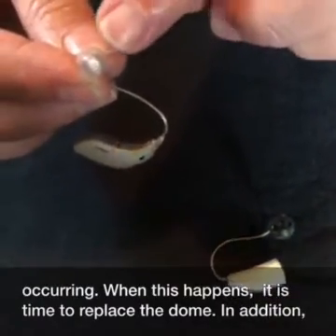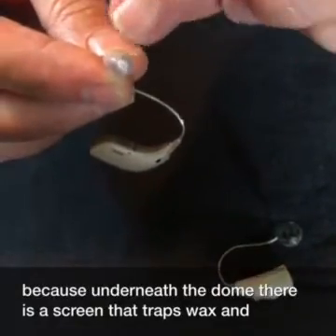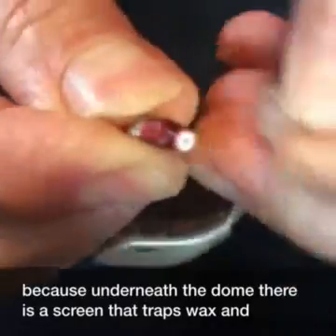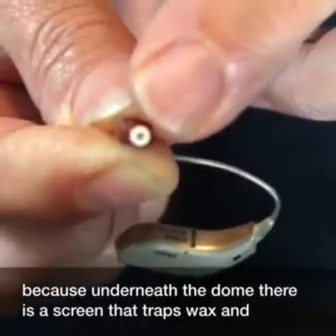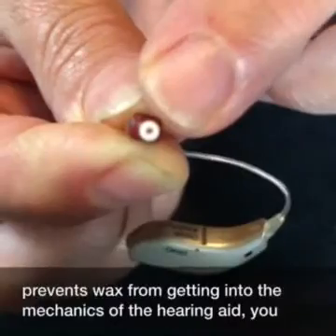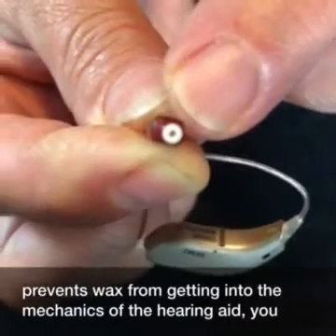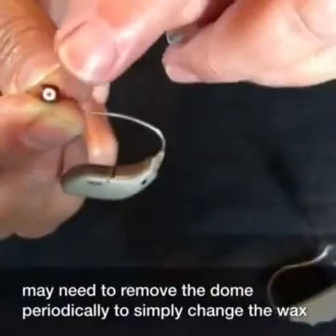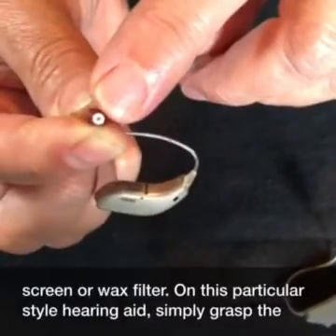In addition, because underneath the dome there is a screen that traps wax and prevents wax from getting into the mechanics of the hearing aid, you may need to remove the dome periodically to simply change the wax screen or wax filter.